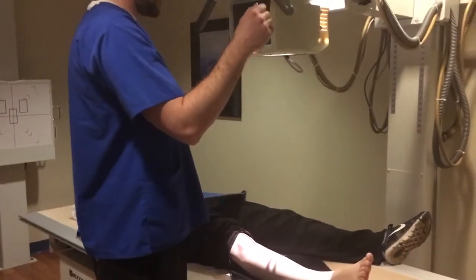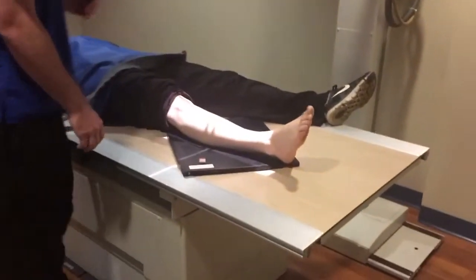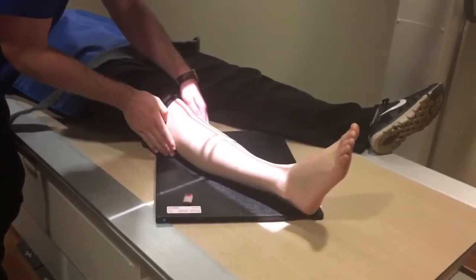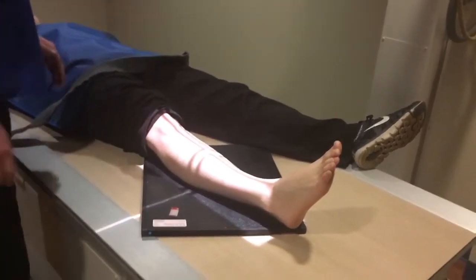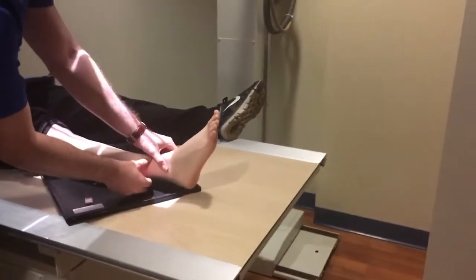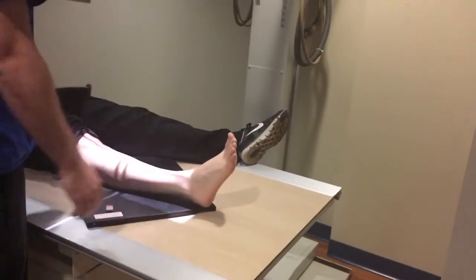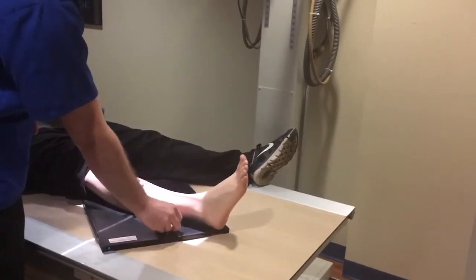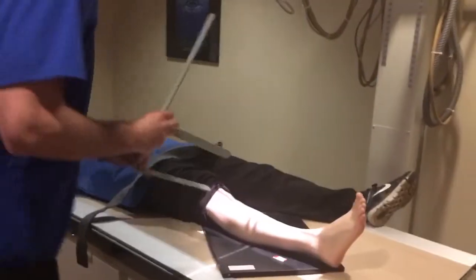The centering for this projection is mid-lower leg, and to check for rotation, you make sure both epicondyles are equidistant from the image receptor and that the toes are pointing up, and make sure you have both joints on the image. We're going to use a right marker for the right leg, and now I will measure at the central ray.